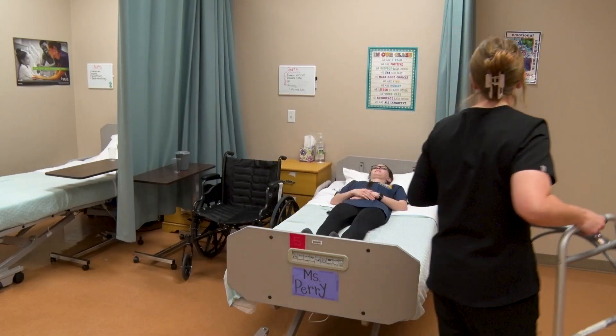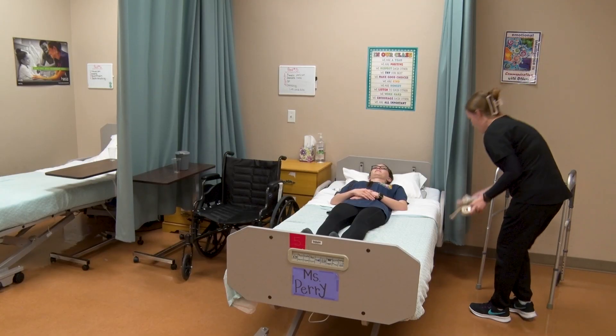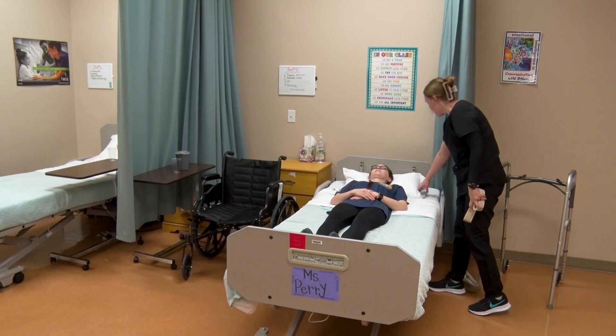Hi, Ms. Sophia. I'm back. I'm going to be sitting the head of your bed up.